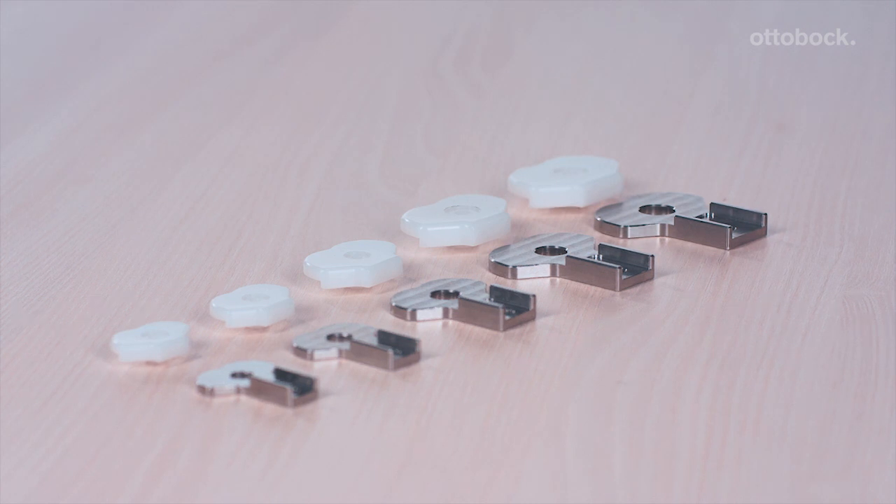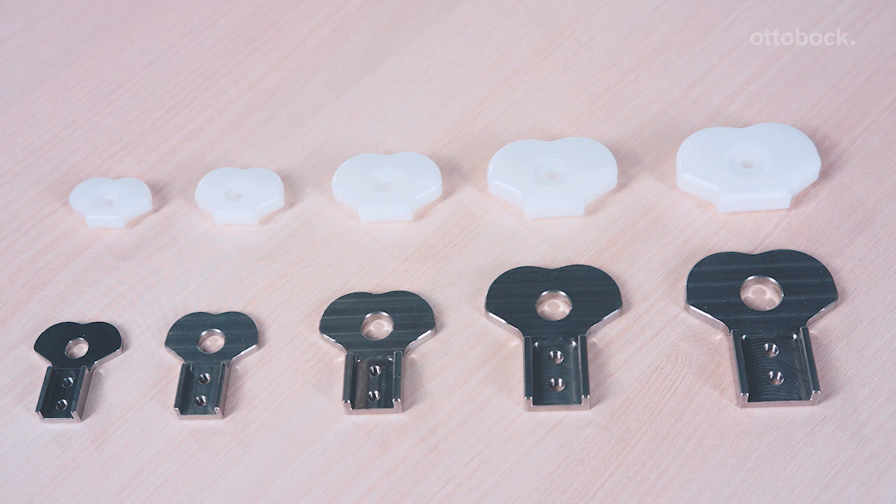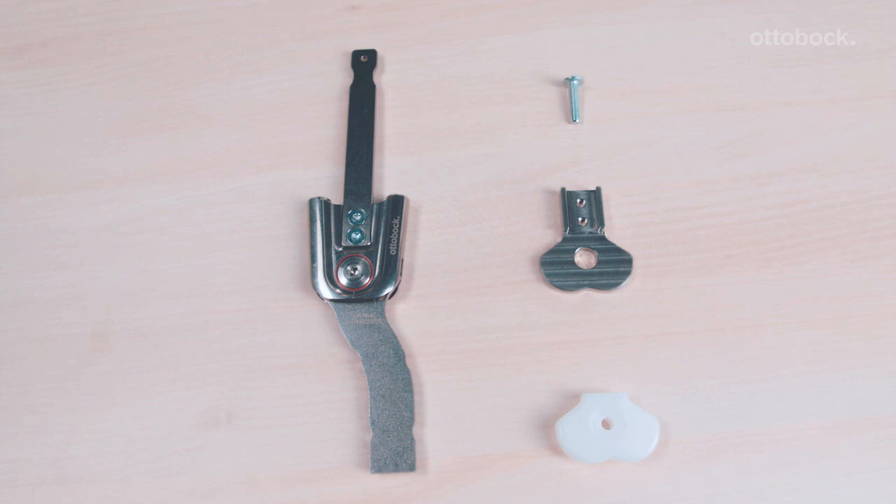The dummy system consists of two components: the reusable lower dummy section made of steel, and the dummy cover made of plastic. This cover cannot be reused. It is included in the scope of delivery of the unilateral ankle joint and can be disposed of after the orthosis is finished.